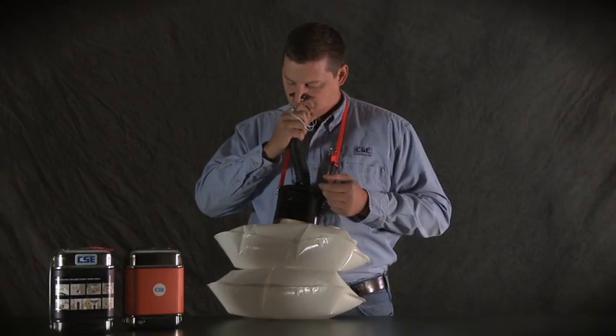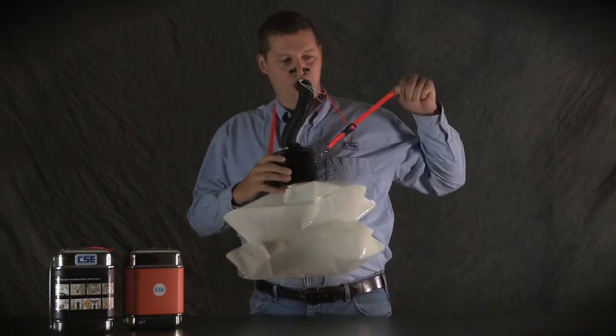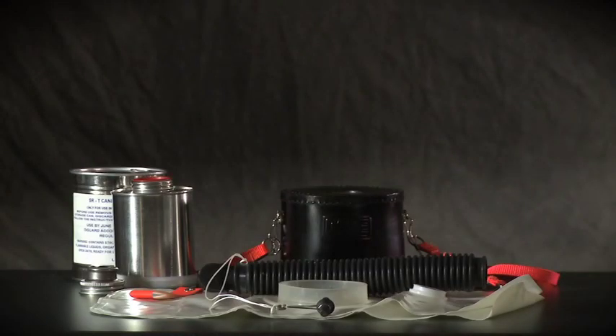When breathing resistance becomes uncomfortably high or the breathing bag is no longer inflated, this training exercise is complete and you can remove the mouthpiece — but don't remove it until the end of the exercise. The oxygen you've been breathing was only about as warm as the air inside a closed vehicle on a hot day, but the canister inside the insulated case will become extremely hot. Don't handle it until it cools off, or protect your hands if you do. And don't set a hot canister on anything that could be damaged by heat.